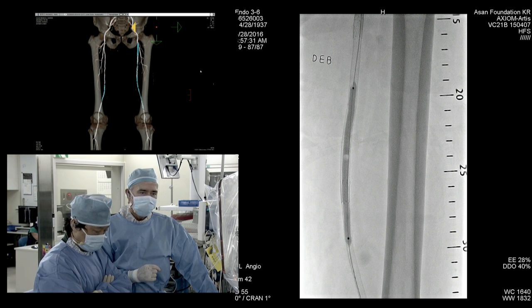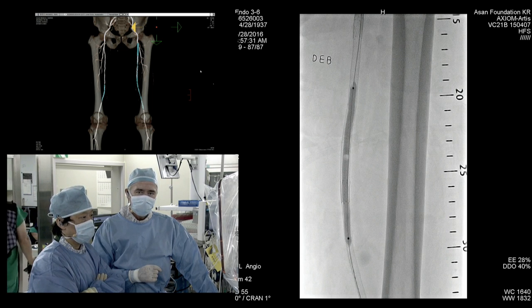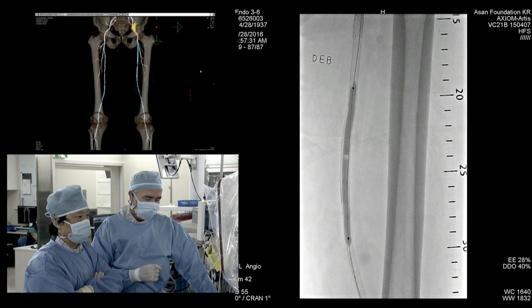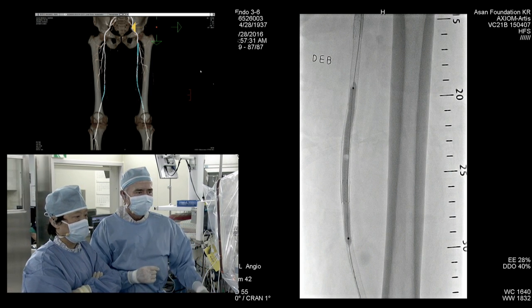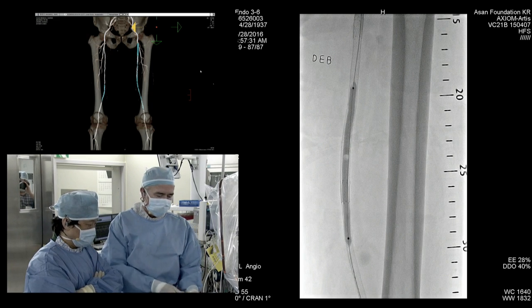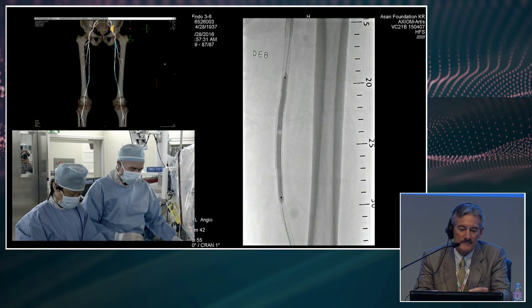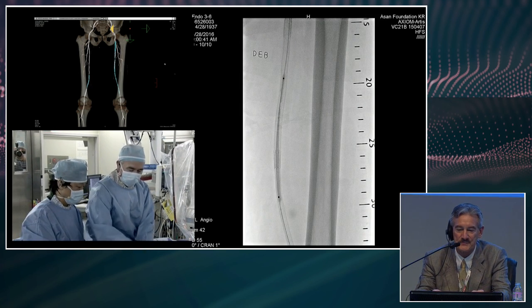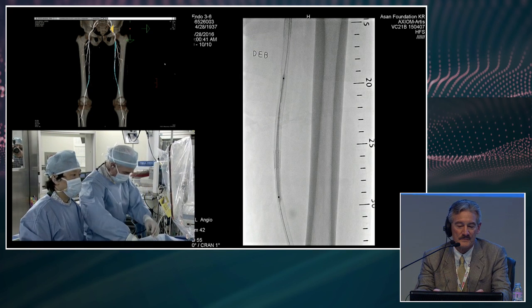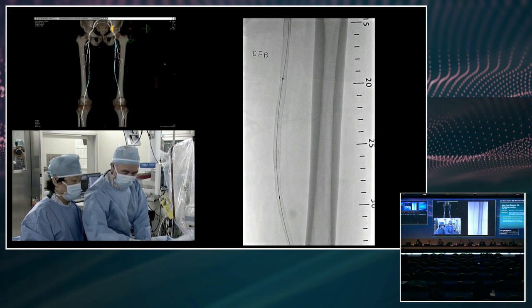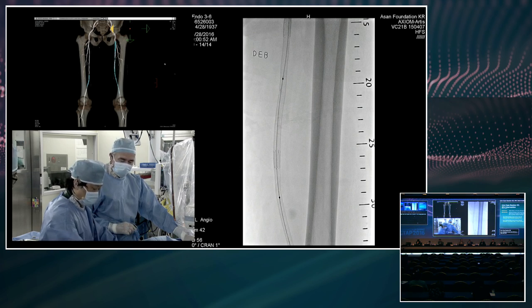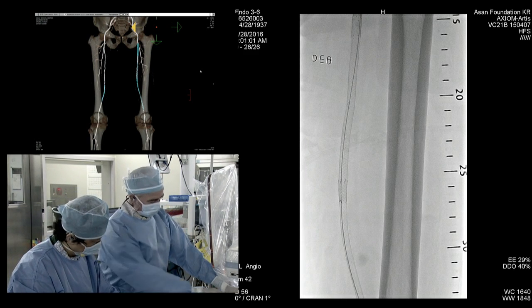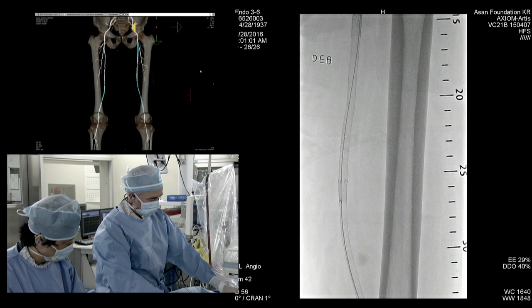We're going to come down, get a final angiogram, and then we'll be done. The three-minute inflations never make for a very interesting live case, but the conversation was great. It's interesting that the restenosis was on the bottom third of the stents rather than the top. Is it just anatomical composition, vessel movement, or was the stent oversized? You have tapering diameter, but the mechanical forces are really the more important aspect — force transmission and longitudinal shortening is greatest in the lower half of the superficial femoral artery.